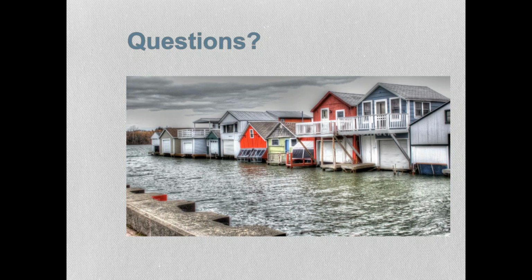There's a question about validation, and this always becomes an issue, especially if you're collecting in media other than formalin. Let me ask you this question from one of our participants. Since IHC validation in the histology lab is done on formalin-fixed paraffin-embedded tissue, how do you validate IHC positivity and negativity on cell blocks?